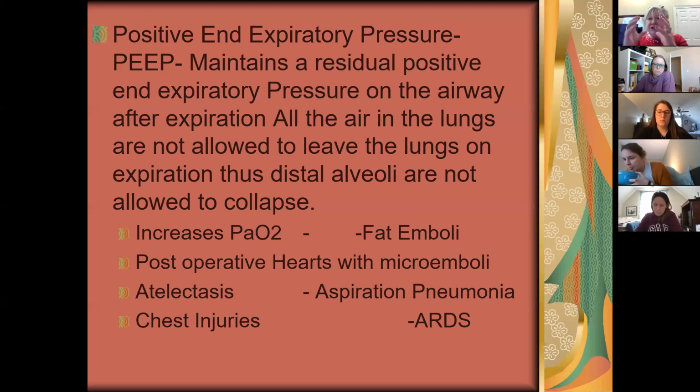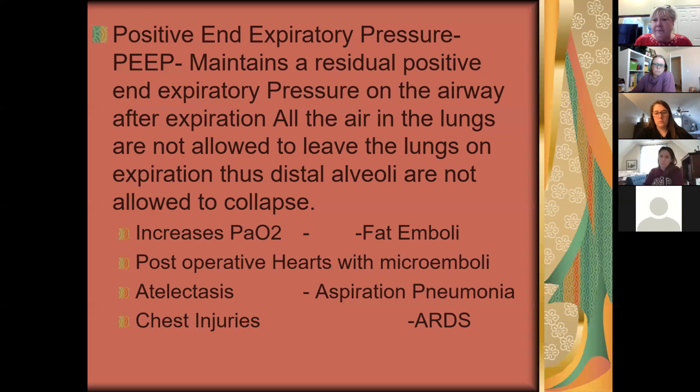Maybe gas exchange could take place while they were standing up. So that's exactly what happens. On expiration, positive end expiratory pressure. Instead of no pressure being in there on expiration, which is what happens to you and I, at the end of expiration, instead of letting all the air come out, just a little bit of positive pressure stays there.